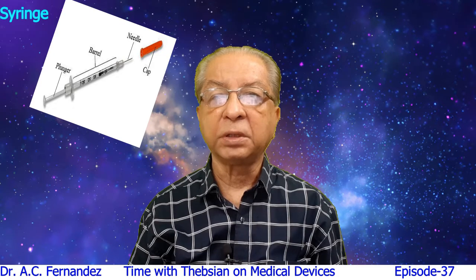Usually the syringes will have a clear barrel with bold scale markings in ml or in other variables, and conventional needles are also called safety syringes because they will have a cap covering the needle if the syringe comes with an attached needle. A clear barrel is there, a plunger is there, and markings are there, as shown in the picture.